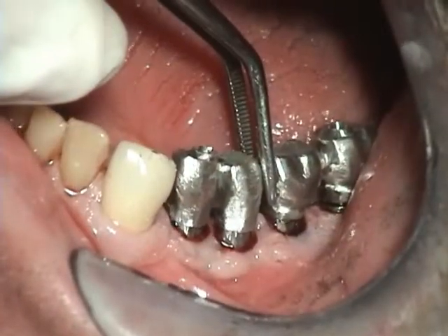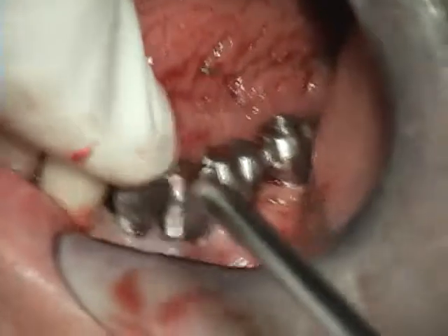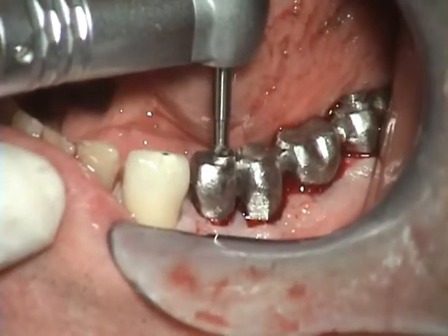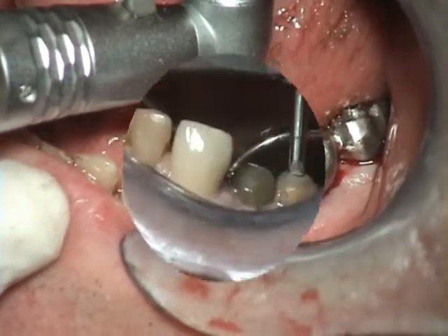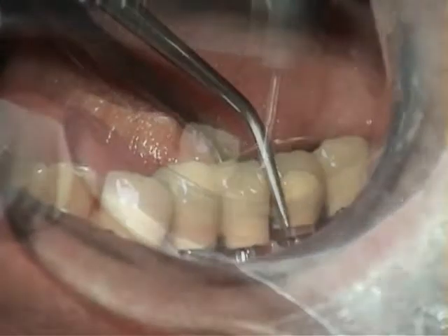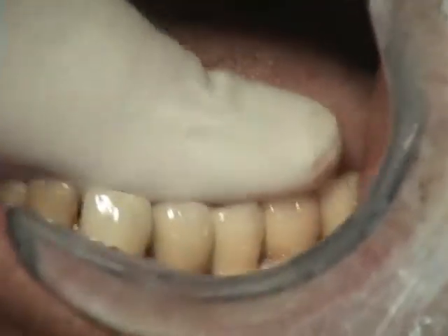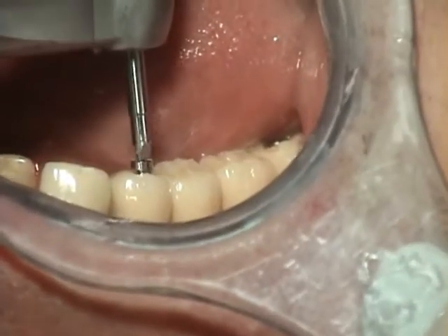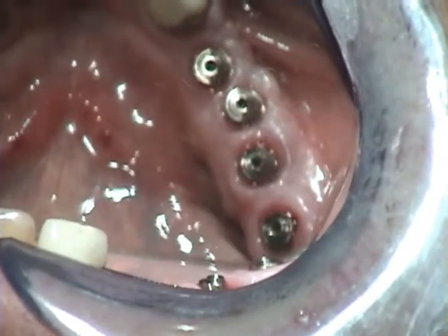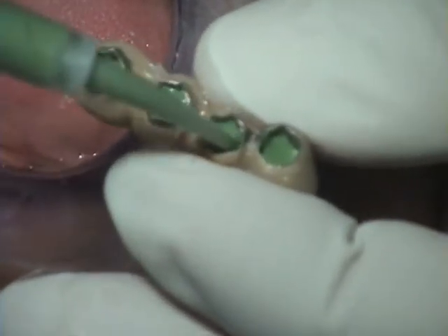This is the magical moment. The back one, right? Mm-hmm. But this one, you can't see it. It's nice. Cool. Adjust the — that's it. It puts some air on it. Looks good. You can look at it just to make sure it's good.